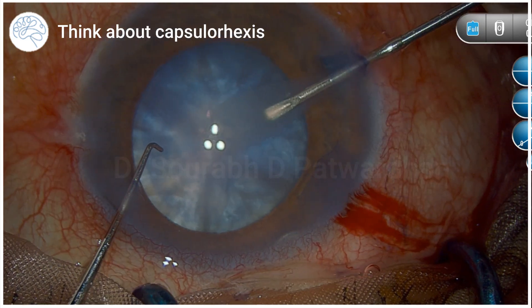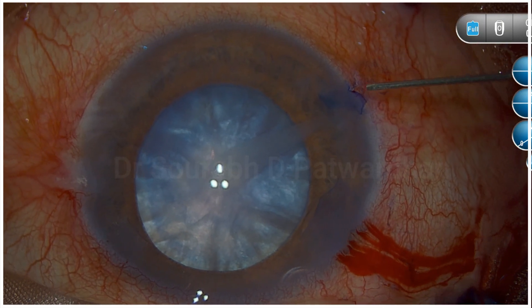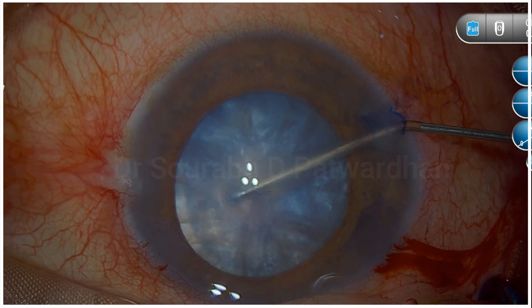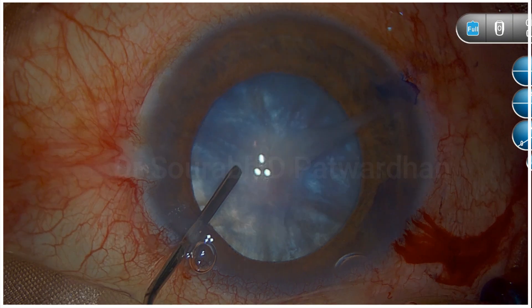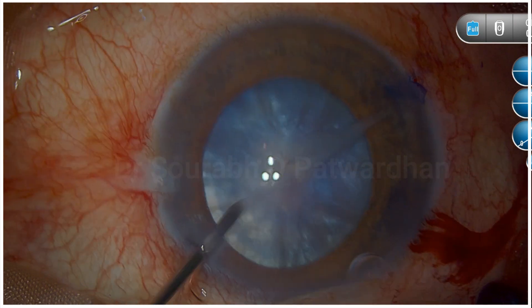For this intumescent cataract, first a nick — a cruciate incision or multiple small incisions made at the center using the right side port — and then a 27-gauge cannula is used to aspirate the cortex. This surgeon is doing exactly what the surgeon was taught when operating under supervision.